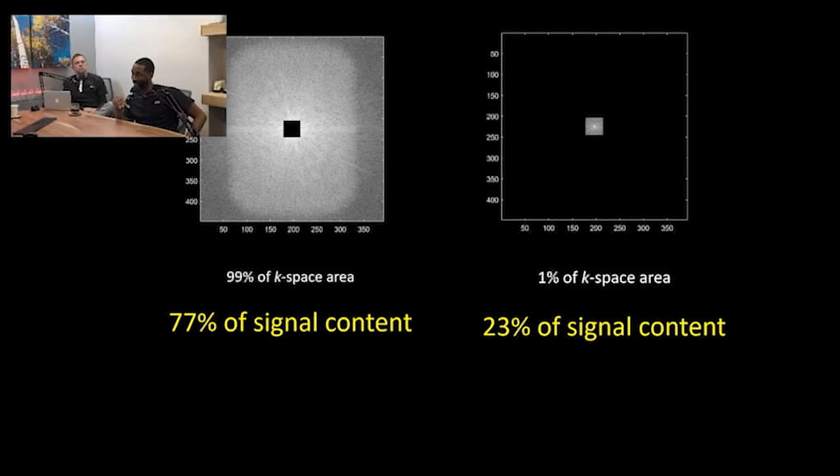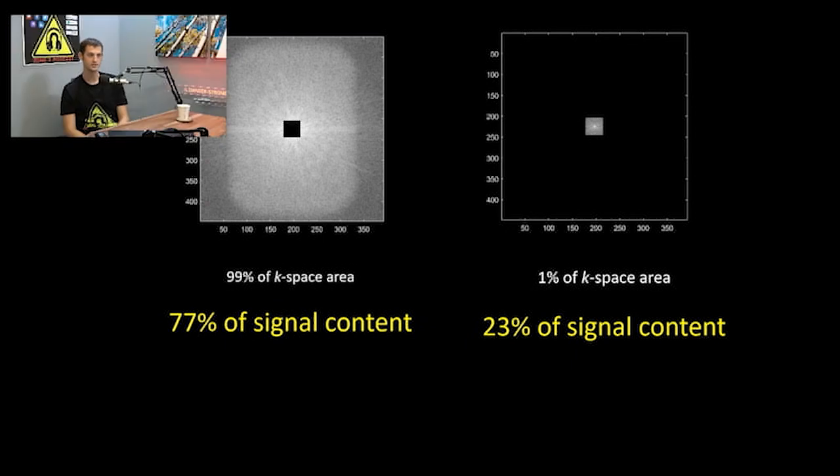It does. As you get a bigger matrix, you've got to encode more. And then the last step of this is the idea of parallel imaging. If you had a turbo spin echo train of 8 and a GRAPPA acceleration factor of 2, you're now grabbing 16 lines for every TR. And in GRAPPA, it starts with fully sampling the center.